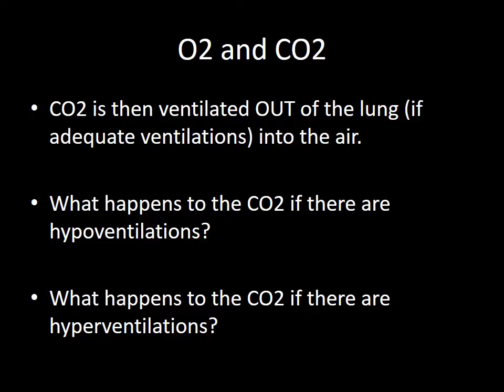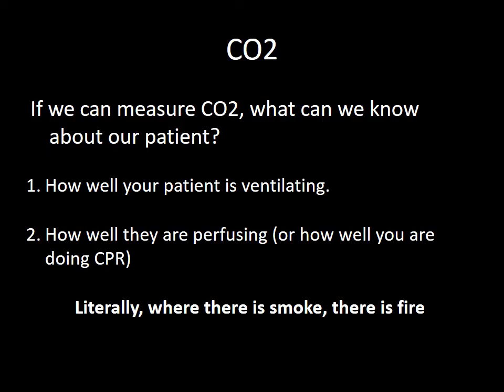But remember that hypoventilation, low ventilation, is going to have high carbon dioxide, and hyperventilation is going to have low carbon dioxide. So the premise is if we could measure carbon dioxide, which we can, what do you know about your patient?